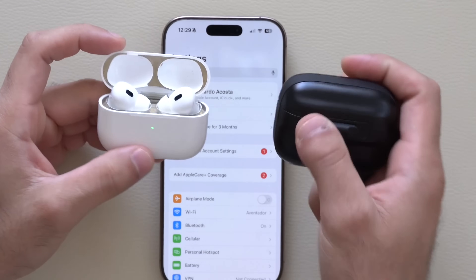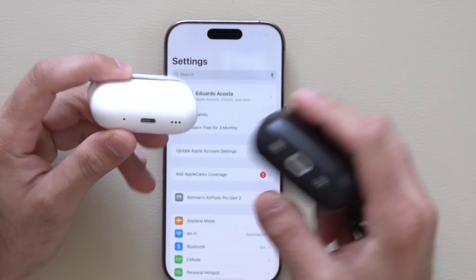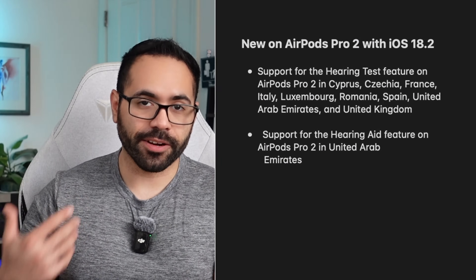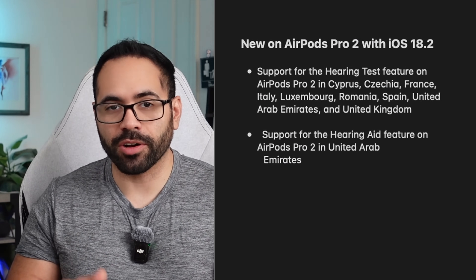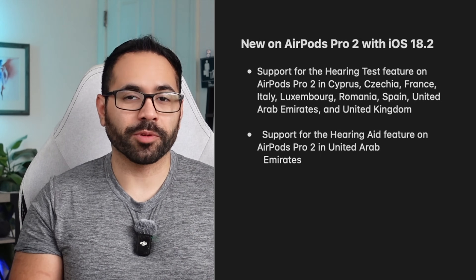These are a pair of AirPod Pros, and it doesn't matter if you have the USB-C version or the Lightning port version — we have both right here. Thanks to the recent firmware update of iOS 18.2, these are not only certified to be used as actual hearing aids, but the hearing aid support is now available in other regions as well.